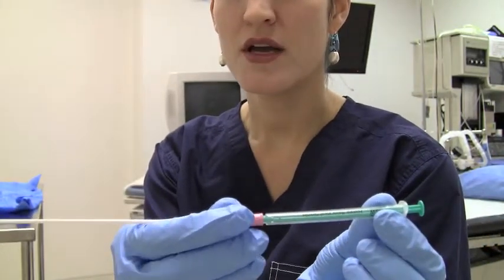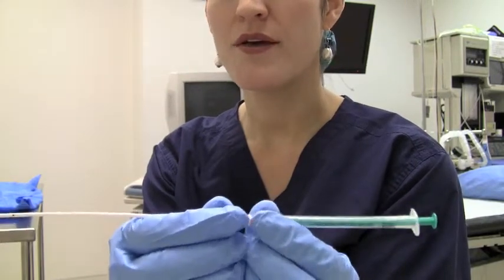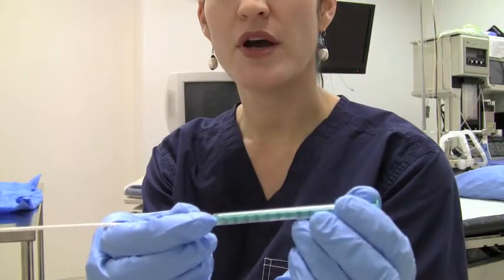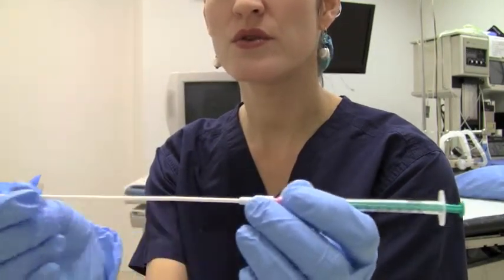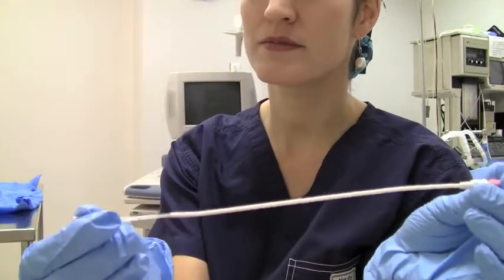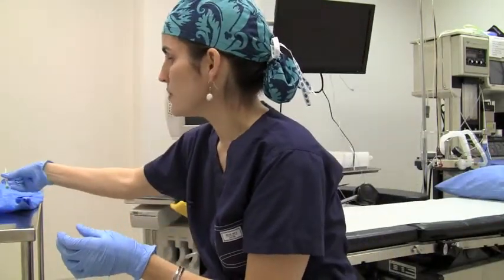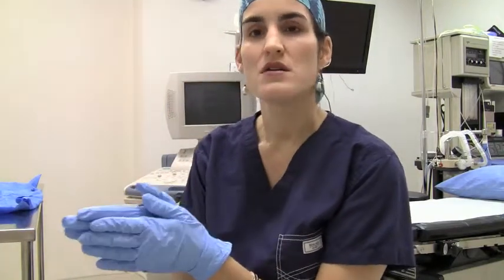The syringe here houses the embryos in a small amount of fluid. After the embryo transfer catheter is placed, the embryologist injects the solution with the embryos through the catheter and into the uterus. Once the embryos have been placed, the catheter is then removed. The embryologist will check under the microscope to ensure that the embryo or embryos have left the catheter.